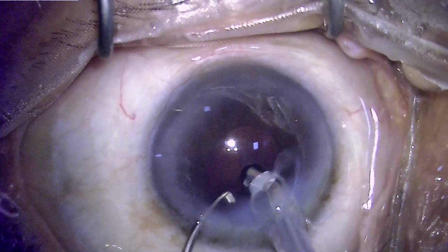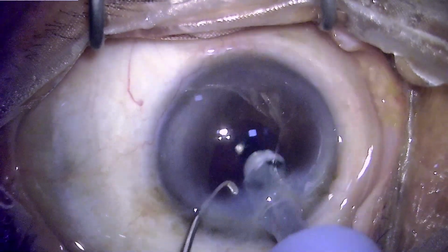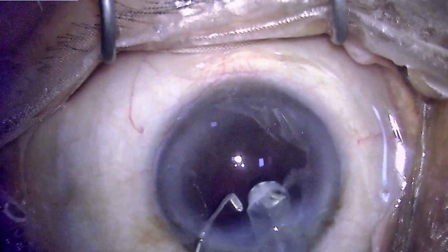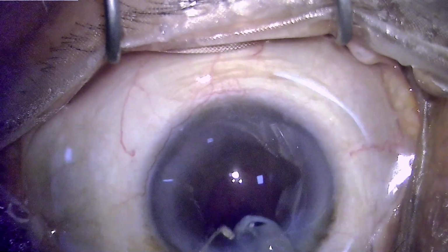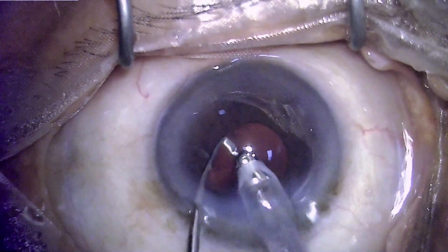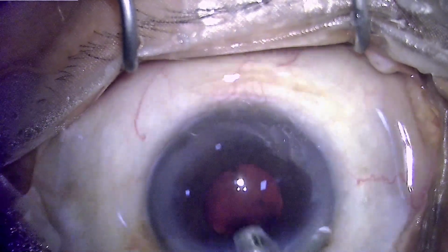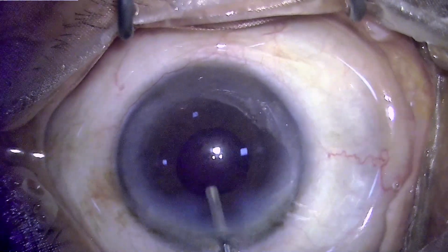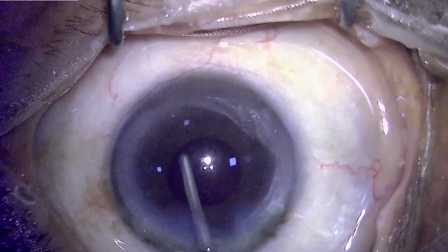Usually these are the steps where a posterior capsular tear can occur, so one has to be very dexterous and take care that the foot switch control is actively manipulating the vacuum and flow rate so as not to catch hold of the posterior capsule. Once the cortex has been cleaned to satisfaction, we can proceed to IOL implantation. Any small debris left behind on the posterior capsule can be polished using the viscoelastic itself.